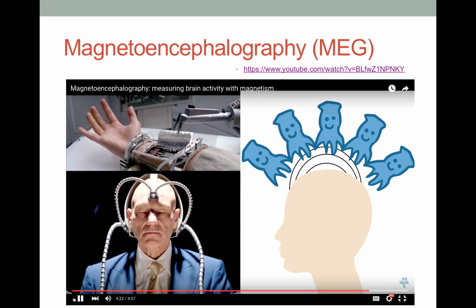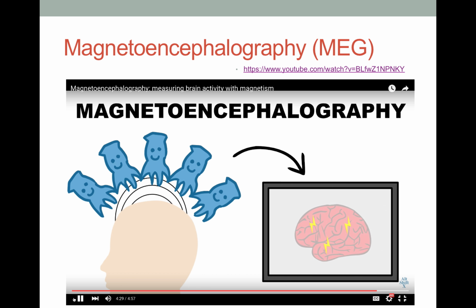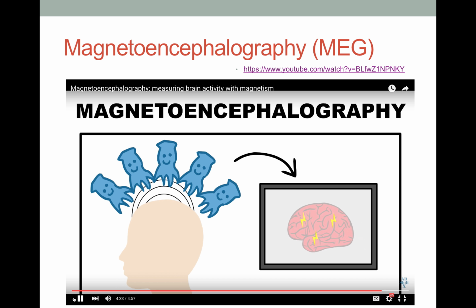and mind reading. In summary, magnetoencephalography works by using supersensitive magnetism detectors called SQUIDs to measure and locate the electrical activity of the brain. You've got to do it in a shielded room and with special cooling, but it's relatively easy to do and has great spatial and temporal resolution.